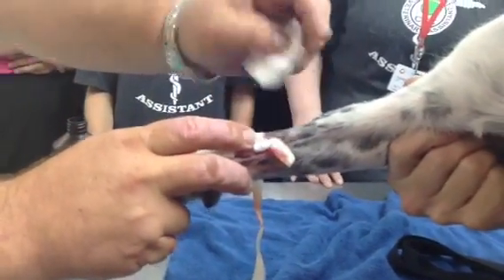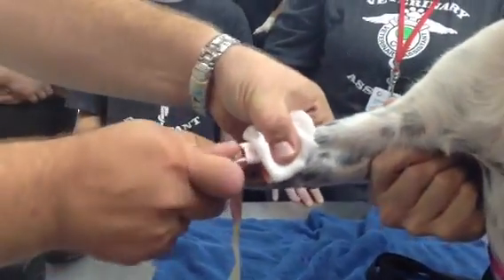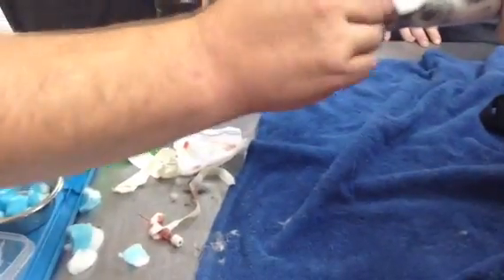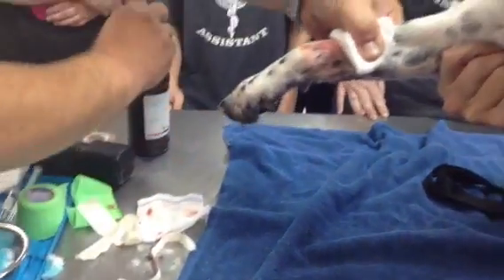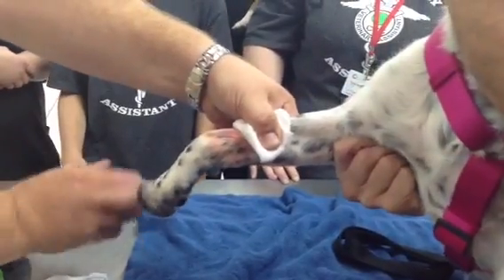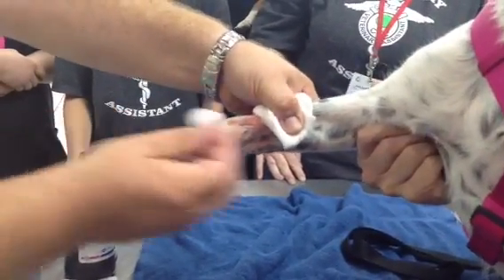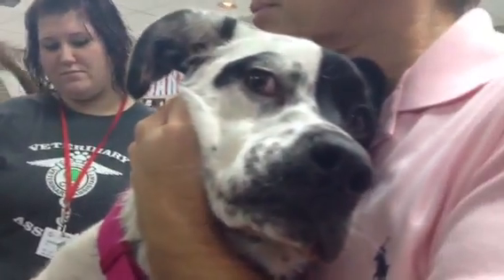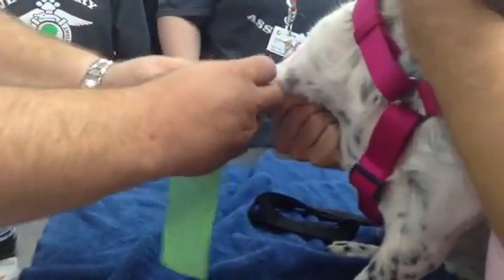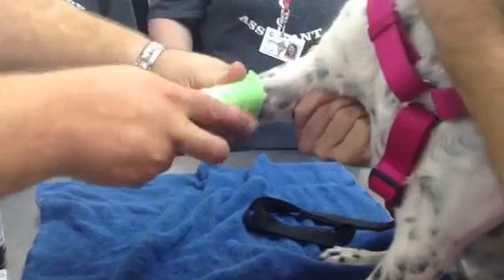See where the catheter goes in. Put pressure right above. Remove the catheter, and then clean around it. Just like when you go to your doctor and have blood drawn.